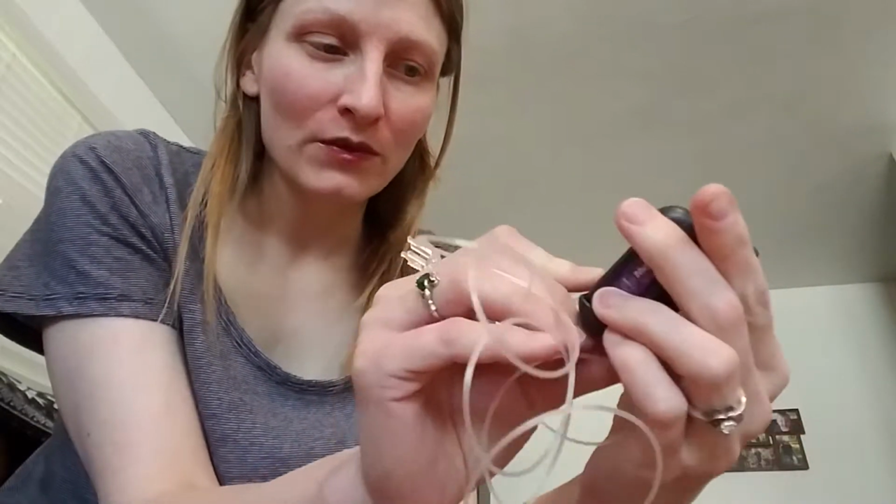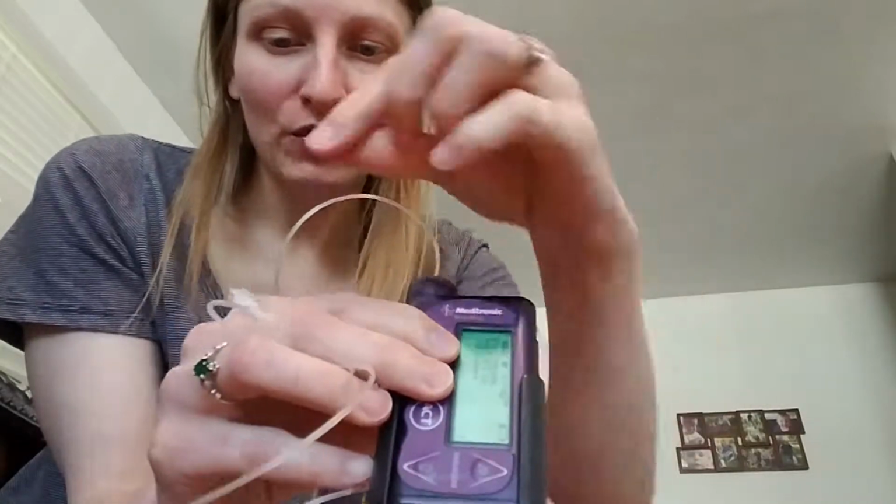It's a constant balancing act. Too much, too little, not good either way. I could die either way. So, yes, I'm disconnected. Now it's really important that I hold it straight up and down, because if there happens to be any little air bubble, it can make a big difference. I'm really sensitive to insulin, so a little bit makes a big difference. So I need to make sure it's straight up and down so that if there are any little air bubbles left in there, they get pushed out first, so it's not a surprise later that there's an air bubble in the tubing.